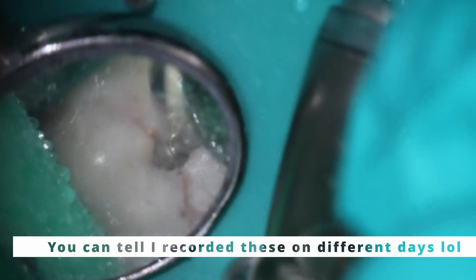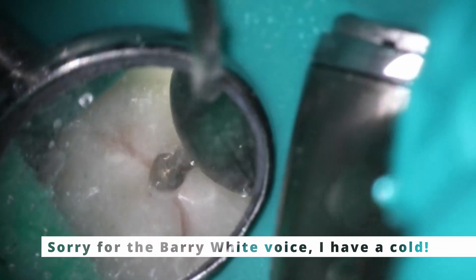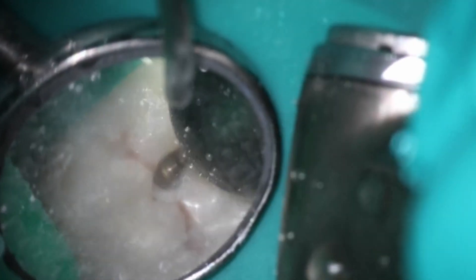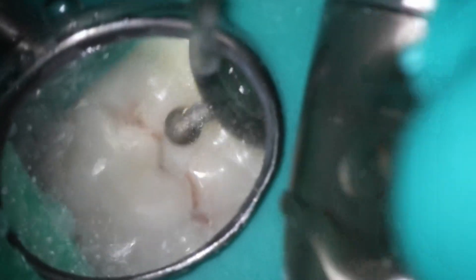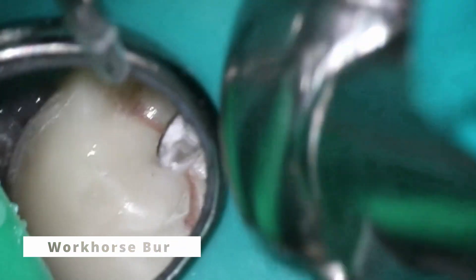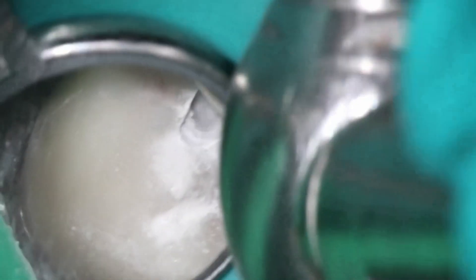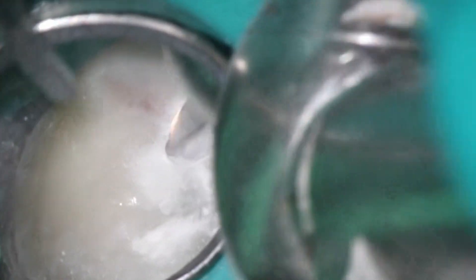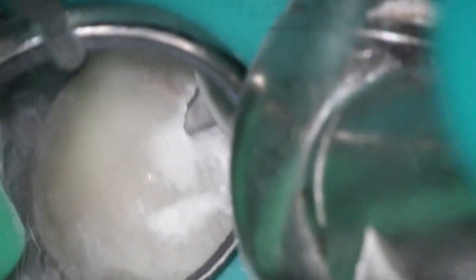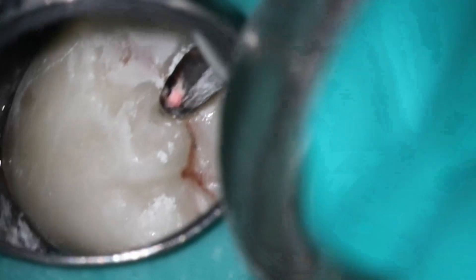As you can see, we're going to be using that blue stripe diamond — and voila, it works. Sometimes even though something is designed to work a certain way, it doesn't always work out that way. Hopefully that little trick about looking at the opacity of the zirconia to discover which burr will work best will help you out. We finally got through the zirconia. Now cleaning everything out, removing the composite. That's where the gutta percha is — a little bit is still covered by composite, so I'm using that skinny diamond just to unroof that.